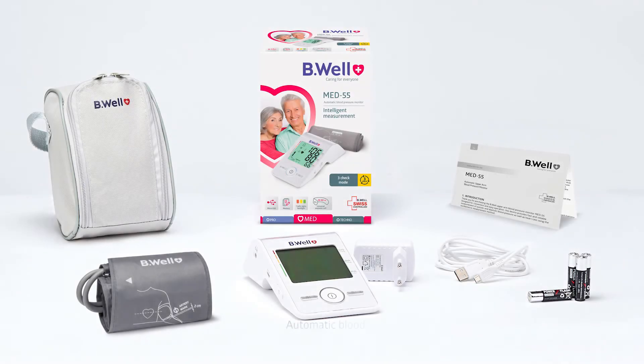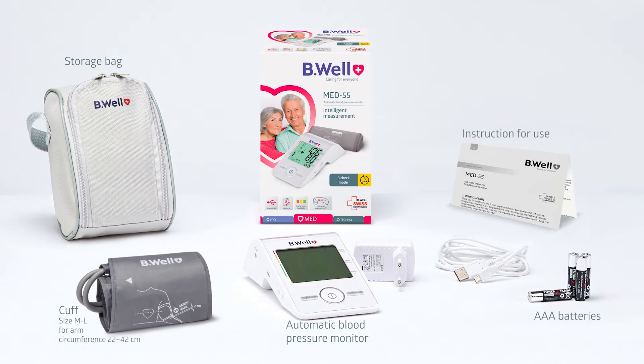The Med55 package includes the automatic blood pressure monitor, an anatomical cuff, AAA batteries, a storage bag, and an instruction for use, as well as a network adapter in the extended configuration.